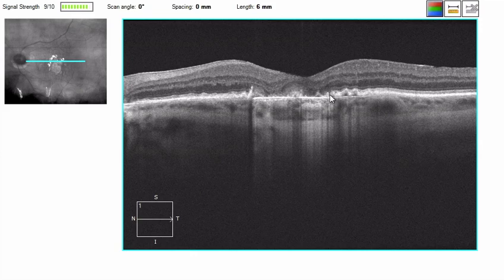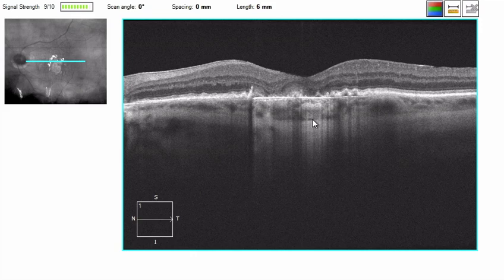Bruch's membrane is visible both temporally and more prominently nasally, though subtly. We can see where the RPE ends, there is an association with increased choroidal brightness. This is because the RPE is normally a highly reflective layer containing melanin, and in the case where the RPE is absent, more light is allowed to penetrate deep into the choroid, and consequently more reflectivity comes from this layer. So we can see all of the choroidal vessels here, and then the sclera down beneath.